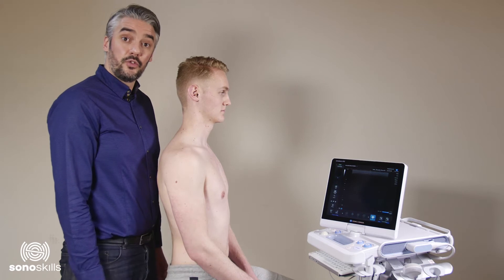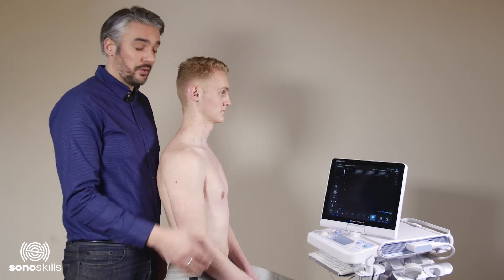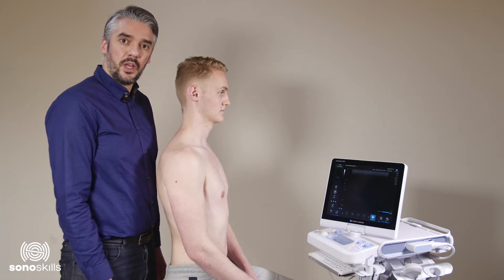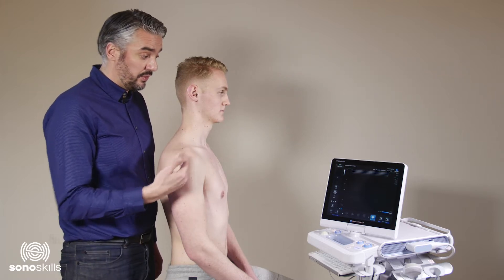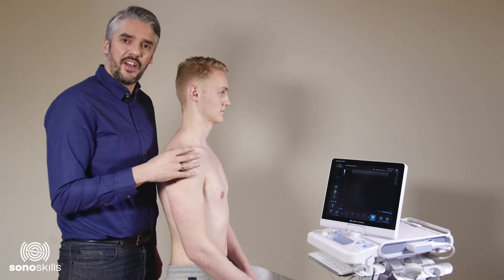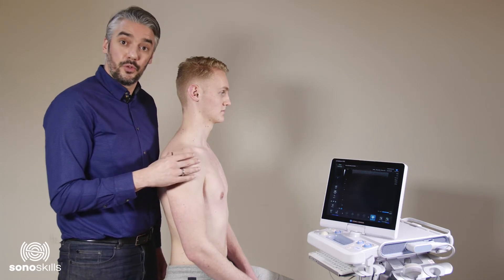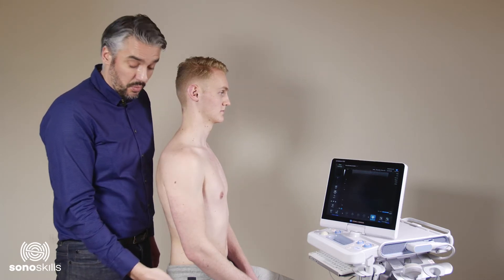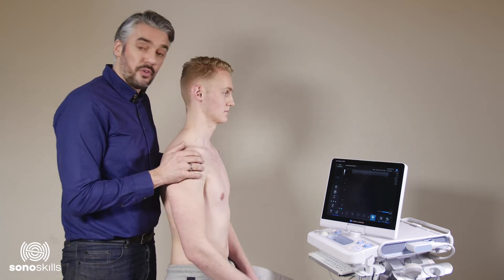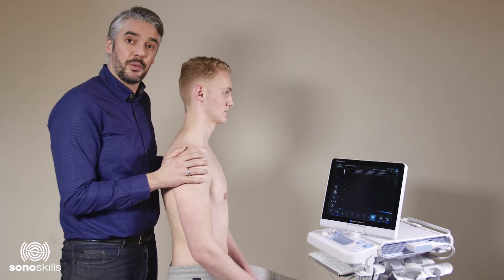Today we will be scanning the shoulder joint using the Konica Minolta ultrasound system with an 18 megahertz linear transducer attached. We strongly recommend that the patient is facing the ultrasound system, as many other positions have been described in the literature but we think this way is the most practical one. The patient is sitting on a revolving stool or chair, which makes it easy to maneuver the patient for the practicability of the ultrasound images.